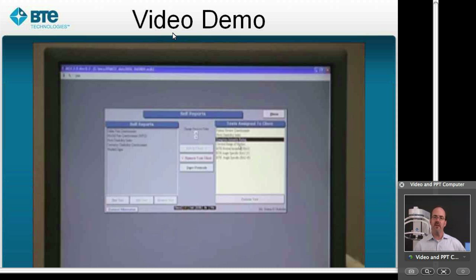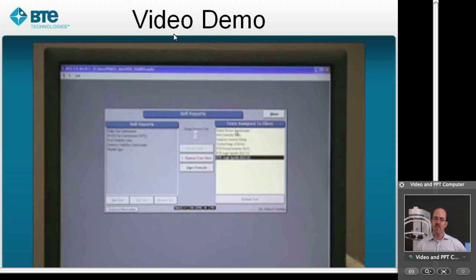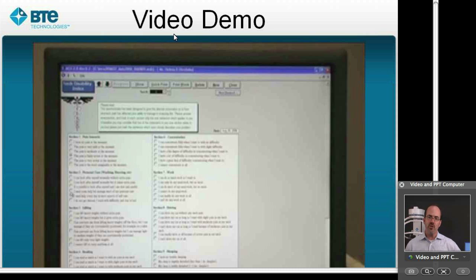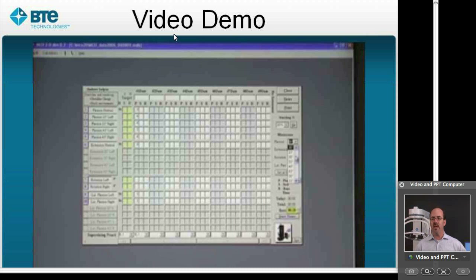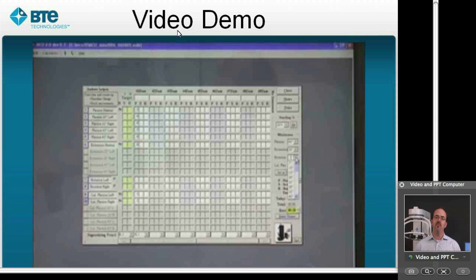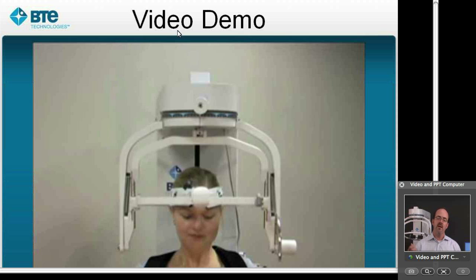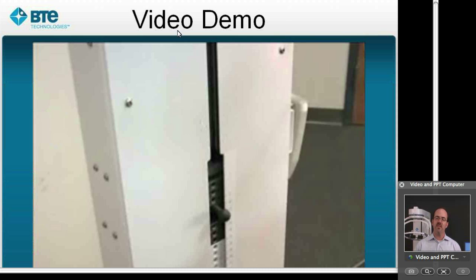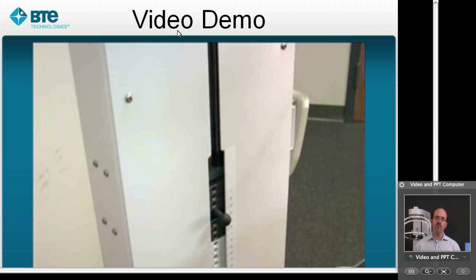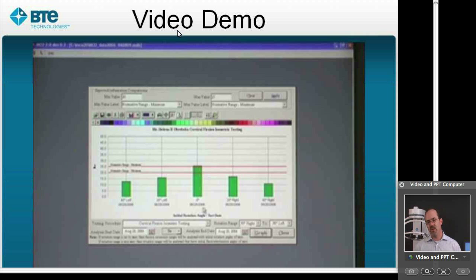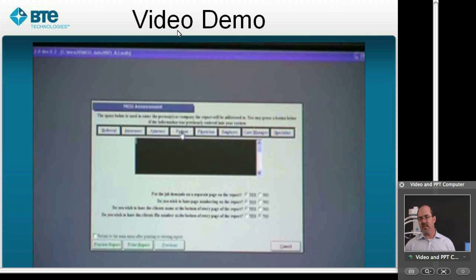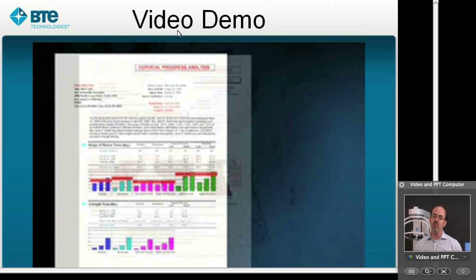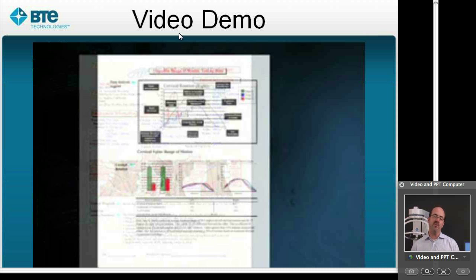Within the protocol, we've got our self-reports — the symptom intensity rating and neck disability index — as well as additional reports such as the Dallas Pain Questionnaire. Once we've created our testing data and collected isometric strength values, we then create an exercise program using the medical-grade weight stack, using half-pound, one-pound, and two-pound weights to strengthen the cervical spine. To generate a report, we select the data collected, select the recipient, and can generate progress or comprehensive assessment reports ranging from one page up to 12 to 13 pages.